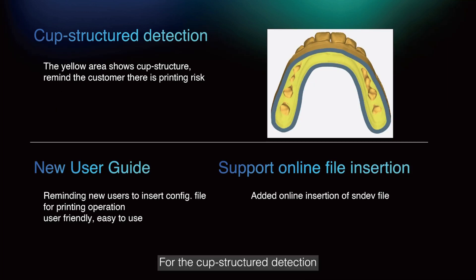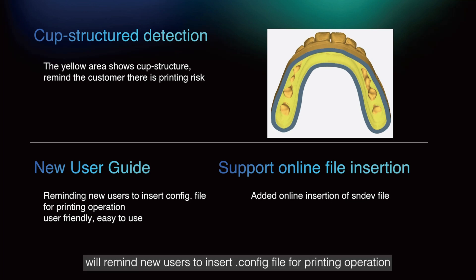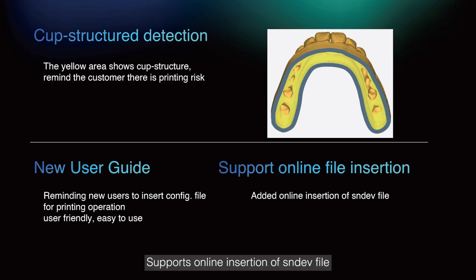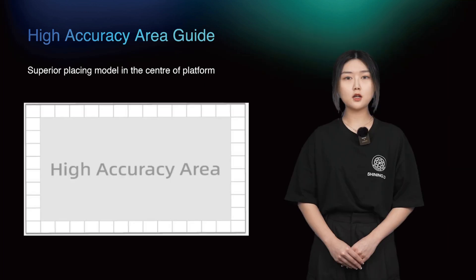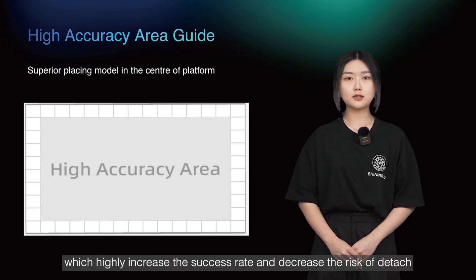For the cup structure detection, the yellow area shows the cup structure, reminding customers there is a printing risk. A user-friendly new user guide will remind new users to insert a config file for printing operation, supporting online insertion of sndev files. We have also added a high-accuracy area guide in the center of the platform, which highly increases the success rate and decreases the risk of detachment.